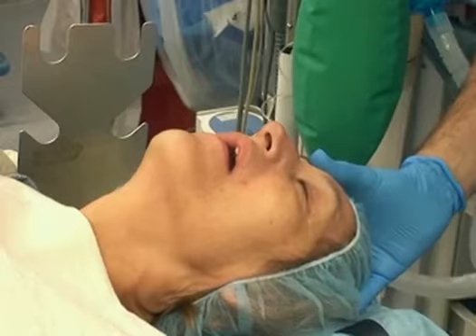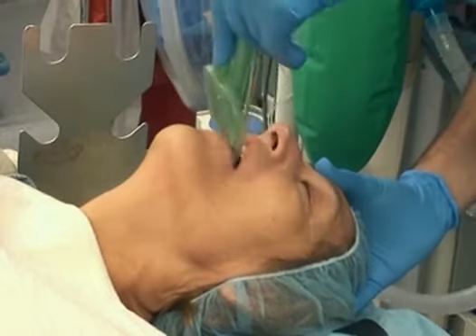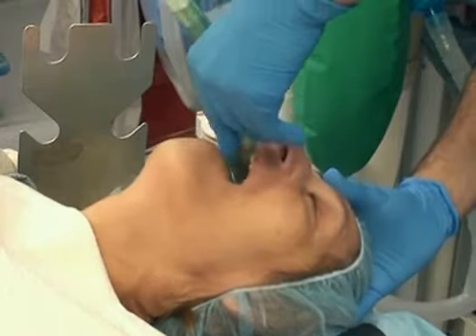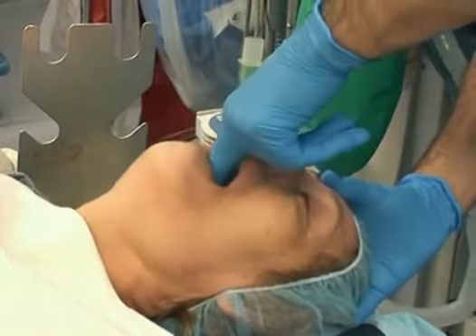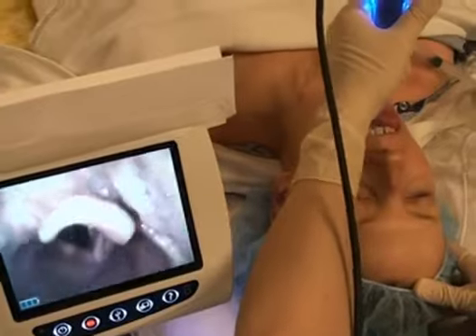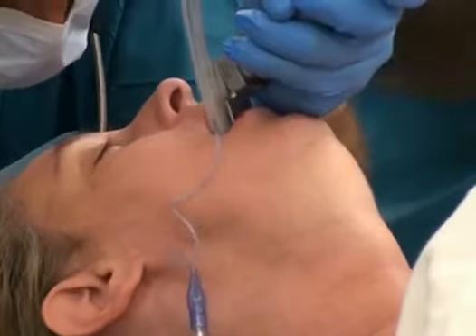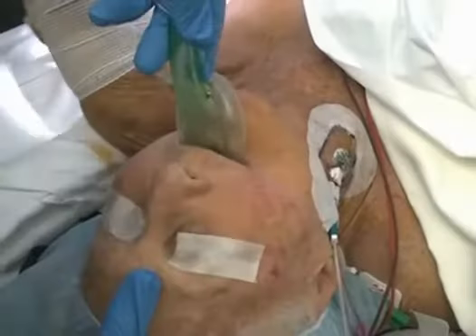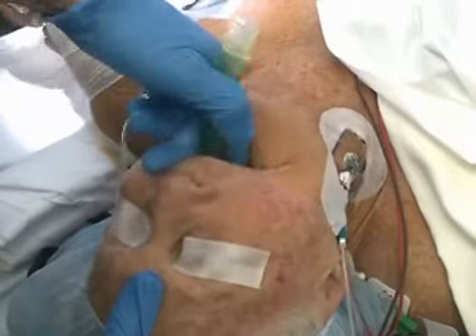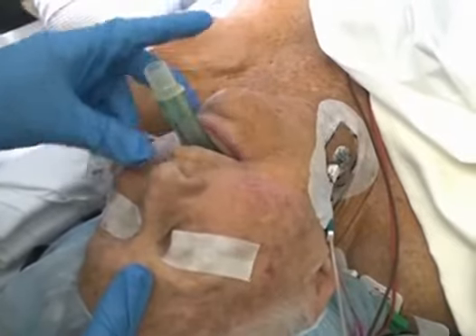Some experts recommend having other advanced airway tools on hand before performing endotracheal extubation. These include supraglottic rescue devices, airway exchange catheters, and a video laryngoscope. If ventilation with a face mask or reintubation is difficult, a supraglottic rescue device, such as a laryngeal mask airway, may allow adequate oxygenation and ventilation.